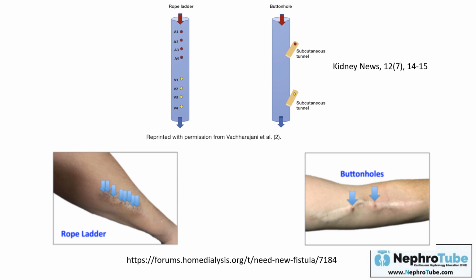But what may be common in practice, but is not right to be used, is area cannulation, where you are cannulating the same area or same region multiple times near each other. In this situation, you are cannulating 1 or 2 centimeters of the vein different times following each other, and this will make weakness of the wall of the vein with the possibility of the formation of aneurysm and pseudoaneurysm.